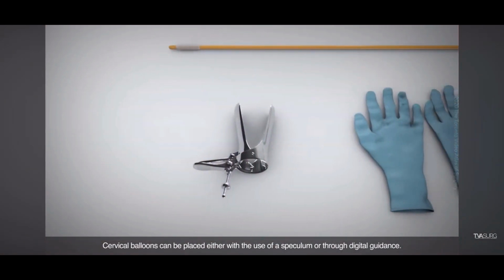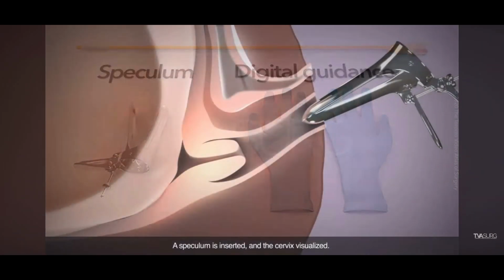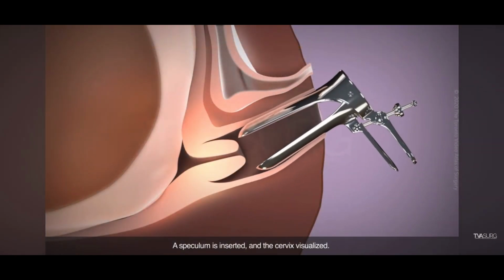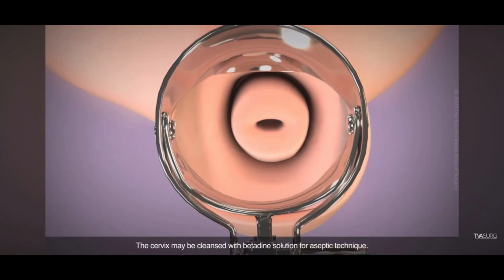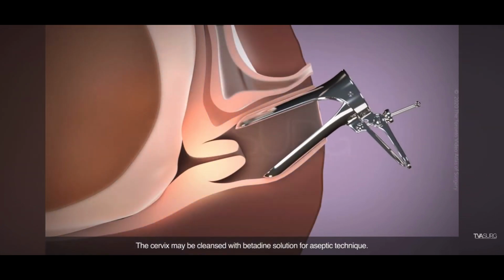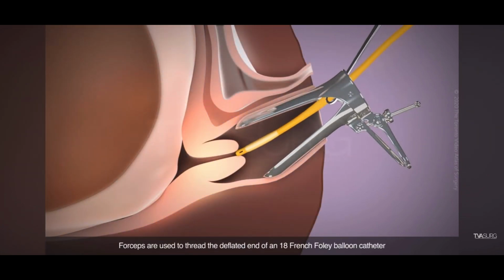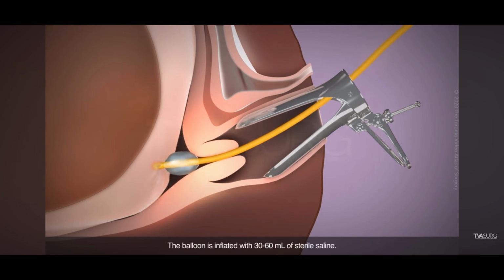Cervical balloons can be placed either with the use of a speculum or through digital guidance. A speculum is inserted, and the cervix visualized. The cervix may be cleansed with betadine solution for an aseptic technique. Forceps are used to thread the deflated end of an 18 French Foley balloon catheter through the internal os. The balloon is inflated with 30 to 60 milliliters of sterile saline.